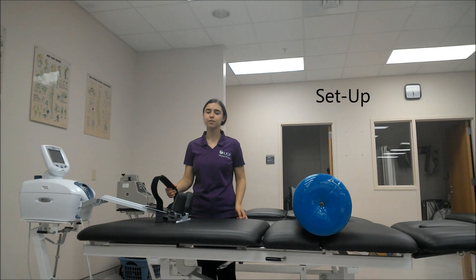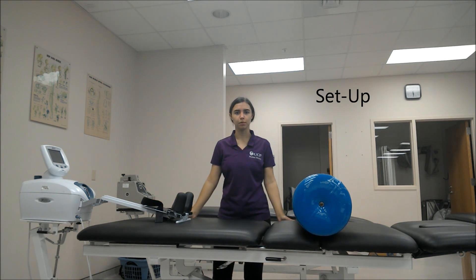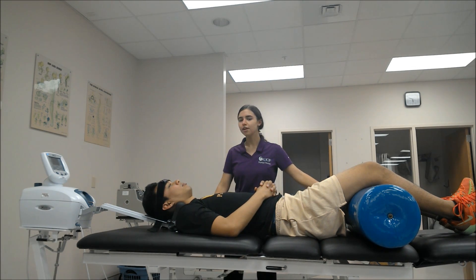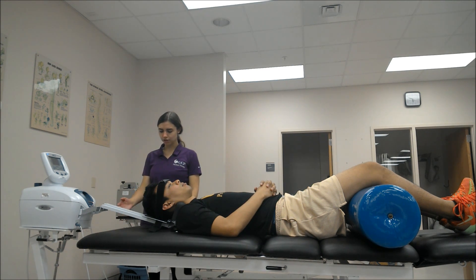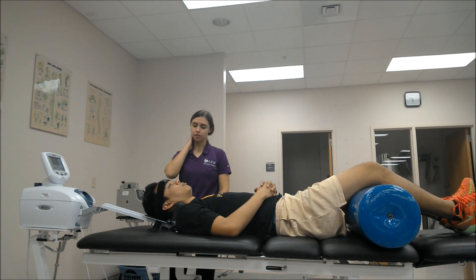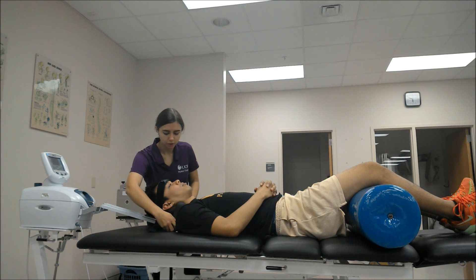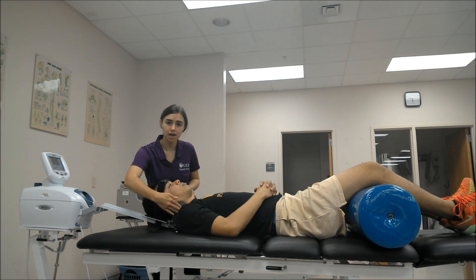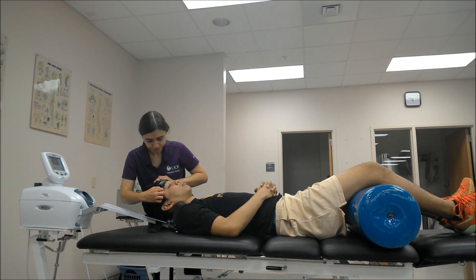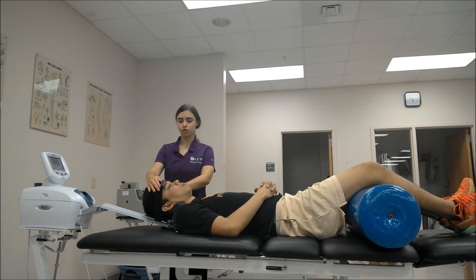Before getting started, make sure that you've cleaned the halter and that the table is locked if you're using a split table. Position your patient supine with a bolster under the knees for comfort. Then make sure that your angle of inclination is about 25 degrees of flexion for this patient, because I'm trying to target the musculature of the lower cervical spine. Then adjust the knobs of the neck wedges so that they're snug against the occiput, and adjust the forehead strap nice and snug so that it doesn't slip during treatment.